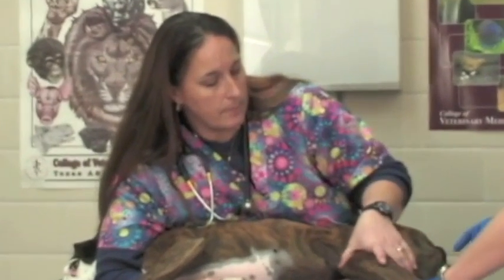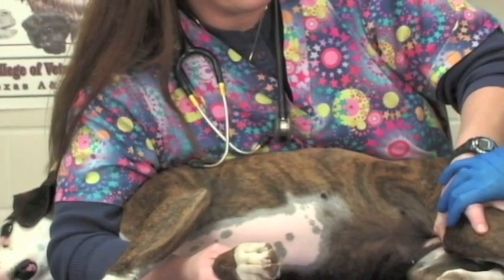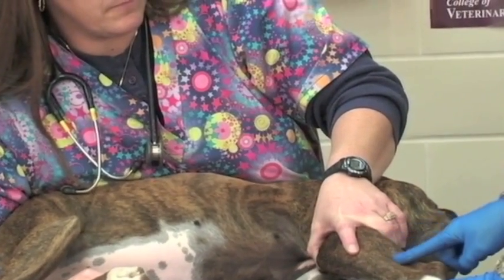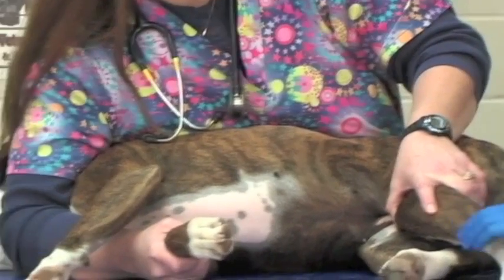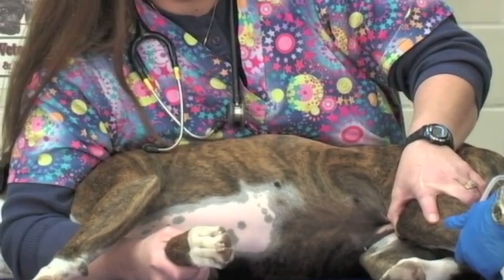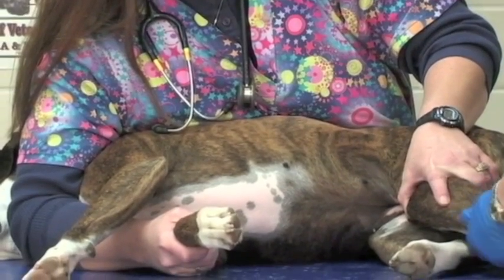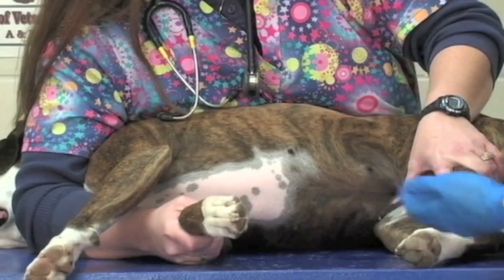The person restraining is going to hold off the vessel by placing her hand around the back side of the patient's knee, and this will make the vessel stand up right here across her rear leg. The vessel runs at this angle, so we lay the hair down again with alcohol, and from this point the procedure is exactly the same as drawing blood from the front leg.